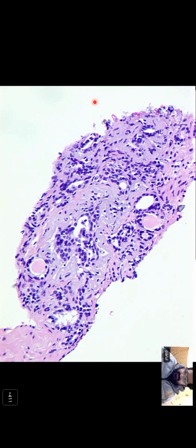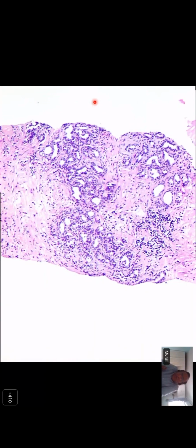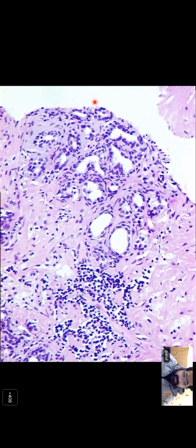Sorry, a couple of things. If you look, what do the glands look like? Do they look pale or do they look dark? Dark. Why do they look dark? More likely due to some nuclear hyperchromasia. Is it just because of the nuclear hyperchromasia? Santosh, if you go one power higher. So the reason they are looking dark is because the cells have very little cytoplasm, right?